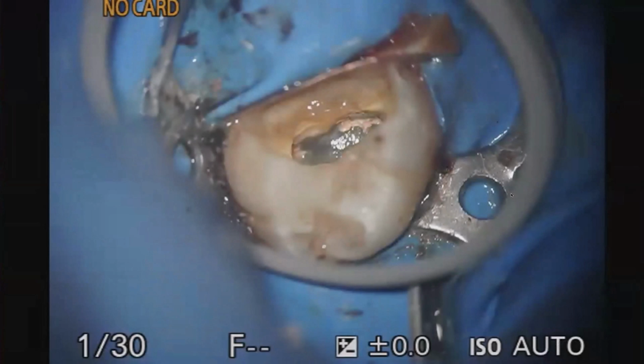In this case, I used an anterior clamp, or basically a butterfly clamp, which kind of kicked the prongs out of the way. I was able to use a wedge and the copper to create that deep margin. And then after I have the deep margin, I'm able to fit any other matrix to create the contact that I want. So it's a step of deep margin elevation that allows for us to seal that wall that's been affected, and also create that seal to allow for us to be able to run the GentleWave.